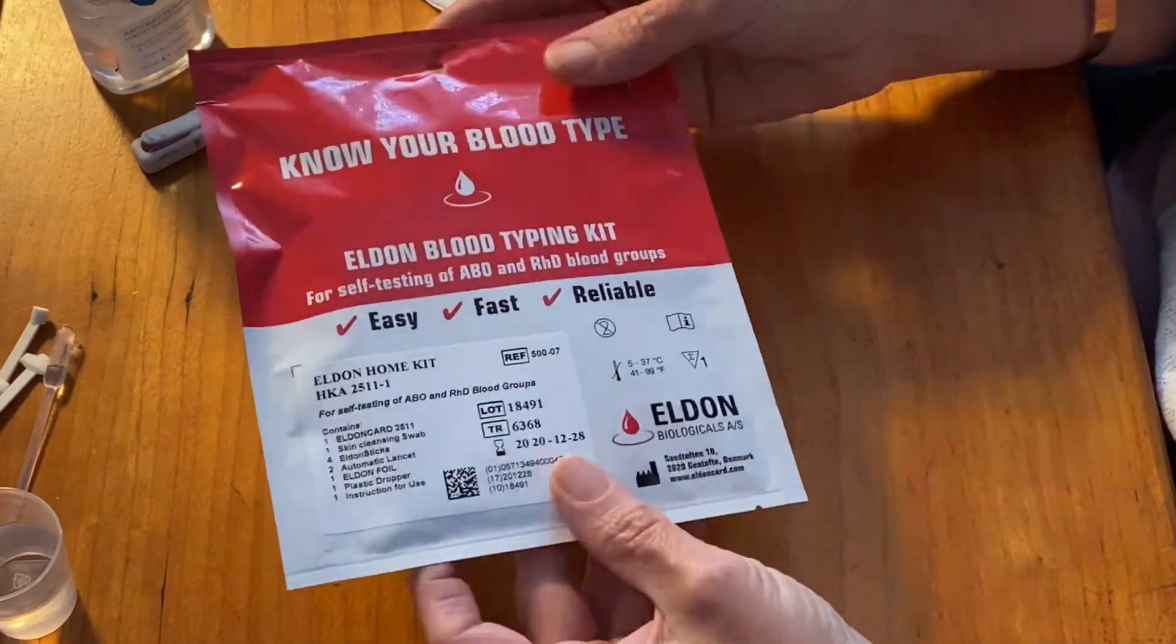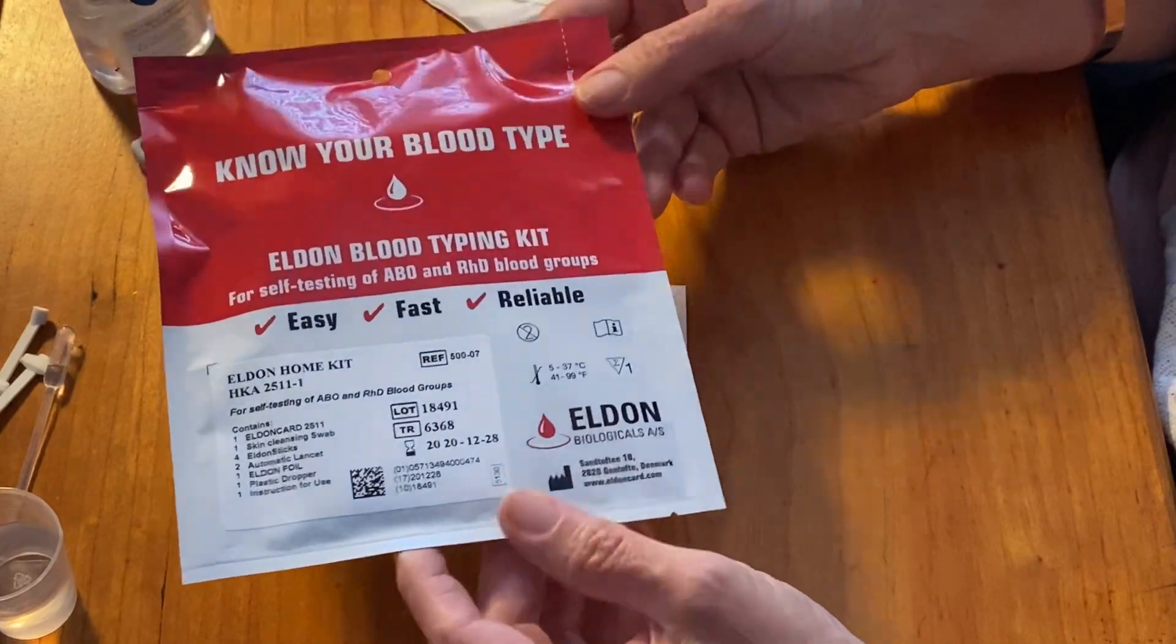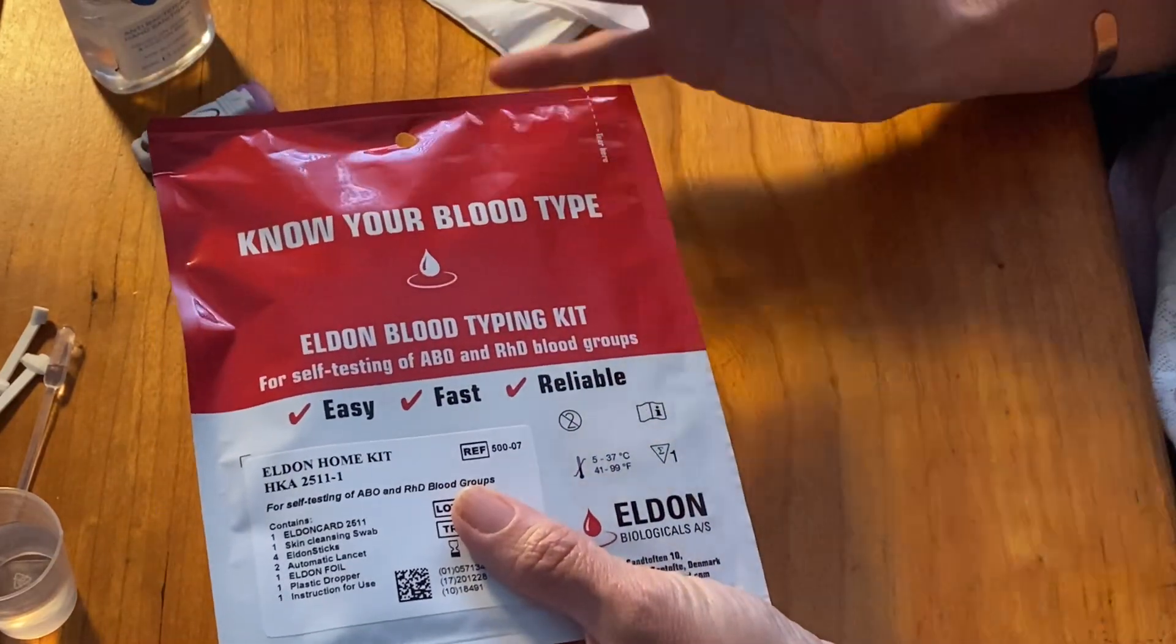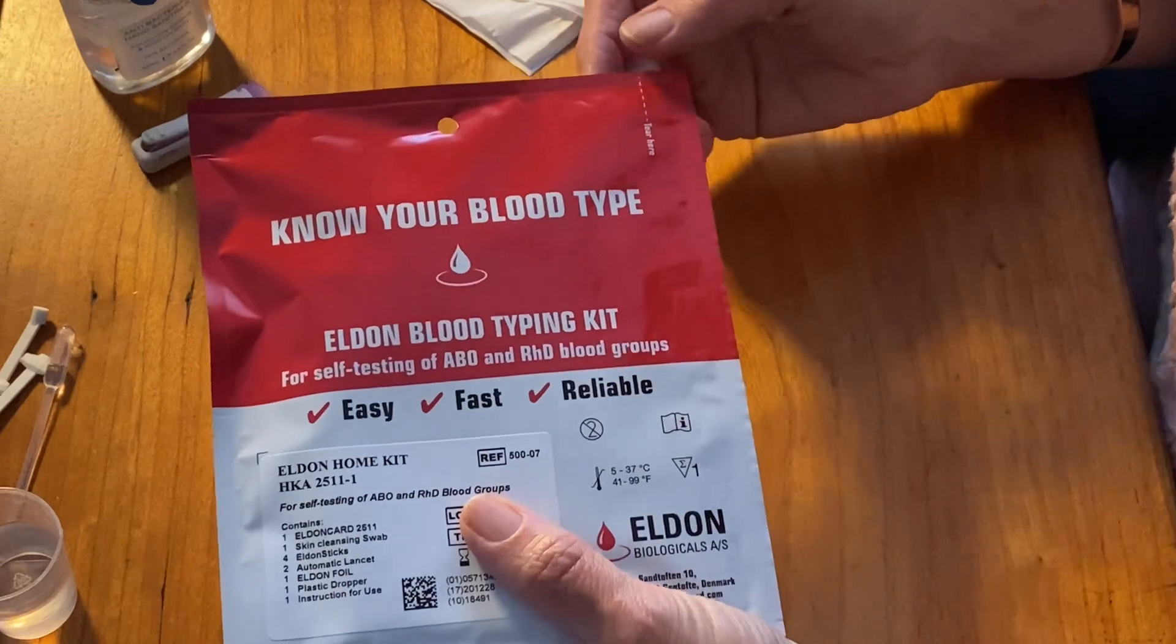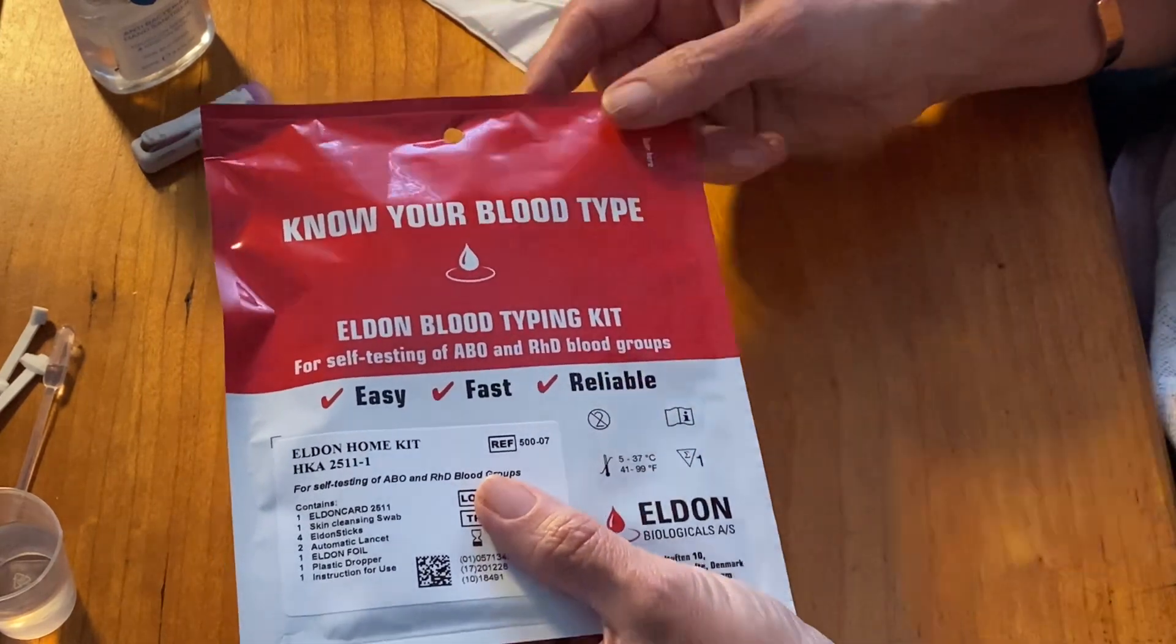You can order these cards online, they're called Eldon Blood Typing Kit. They're available on Amazon. They are about 15 to 20 euro to buy and each comes with just one testing kit.